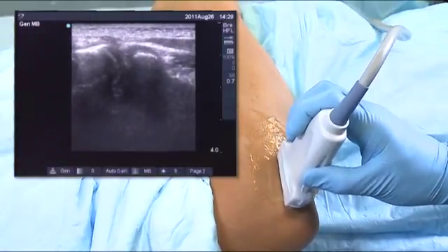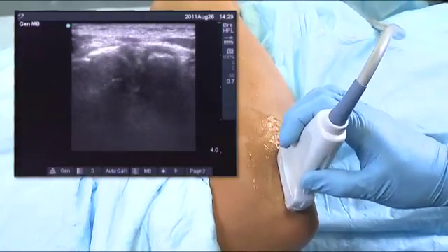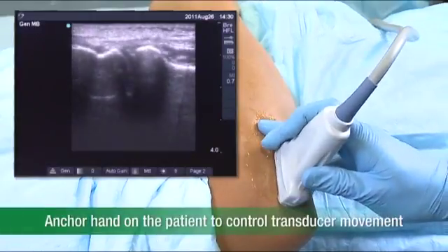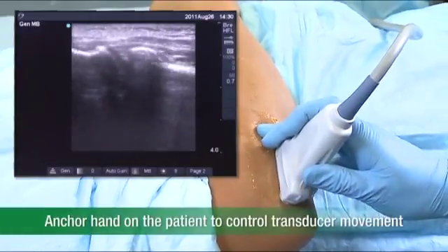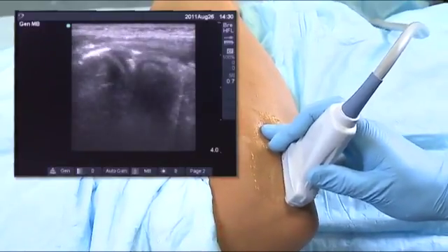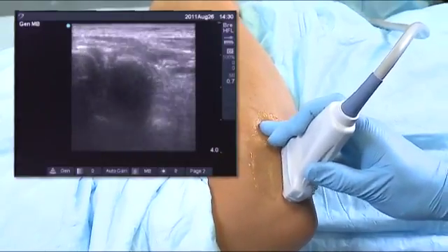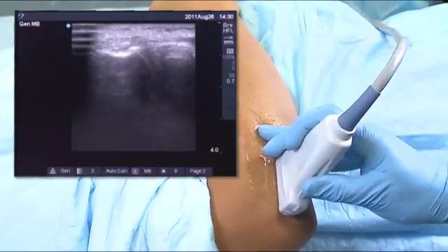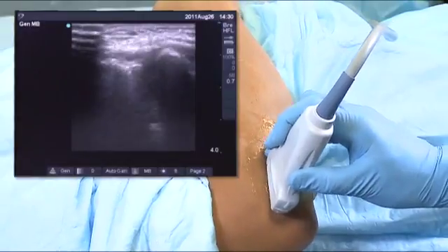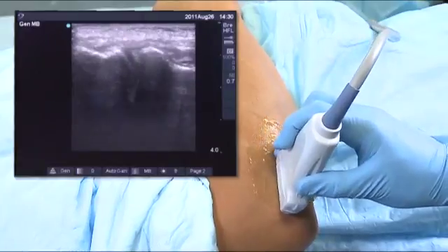So it's important to be well balanced and to have the transducer as perpendicular as possible. Another trick for that is by placing a couple of fingers — my fourth and fifth fingers are placed on the patient — to anchor the transducer so any movements are very controlled and methodical. It's a very gentle, simple sweeping either down the plane or up the plane. In this case, we're looking at the radial head and epicondyle in an anterior or posterior view.